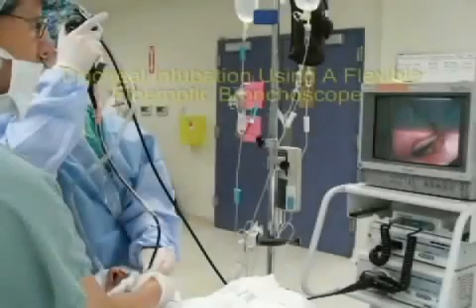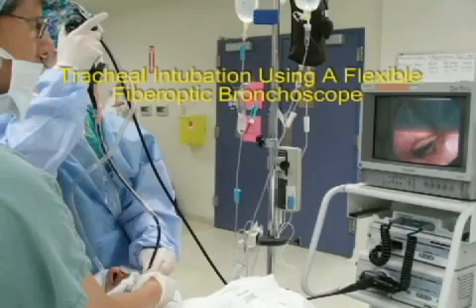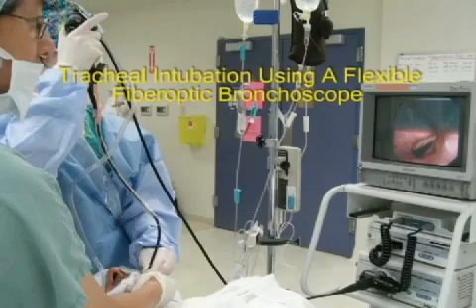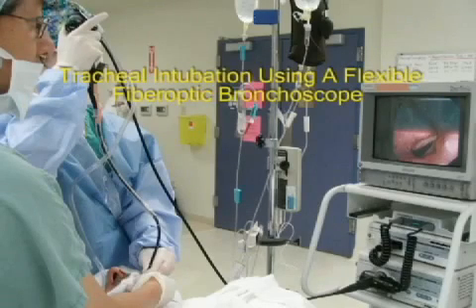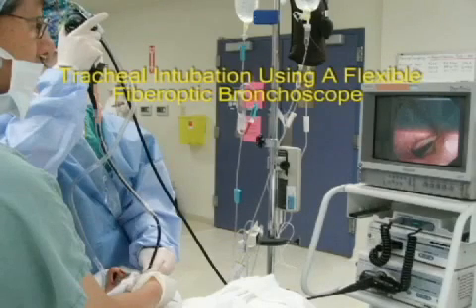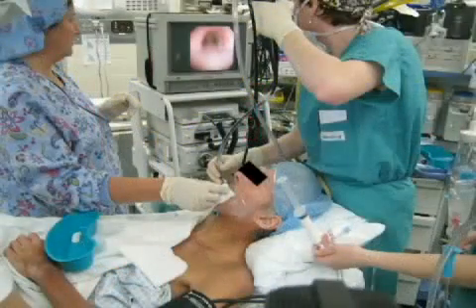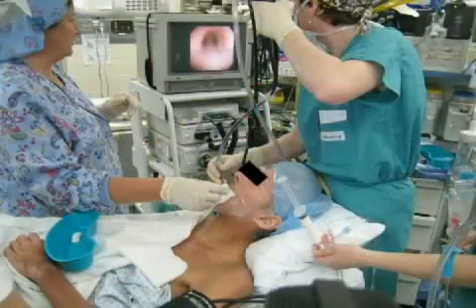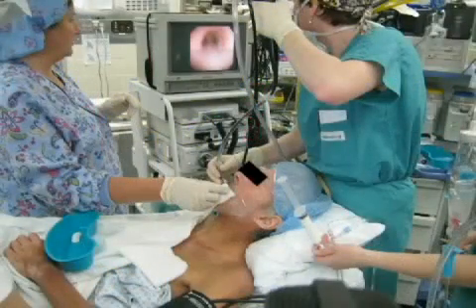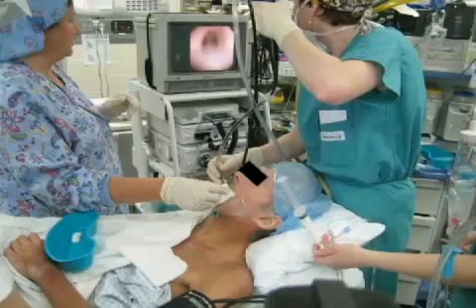While tracheal intubation using a flexible fiber-optic bronchoscope, or fiber-optic intubation in short, can be performed either under general anesthesia or awake under topical anesthesia, this narrative will only discuss the awake fiber-optic intubation.